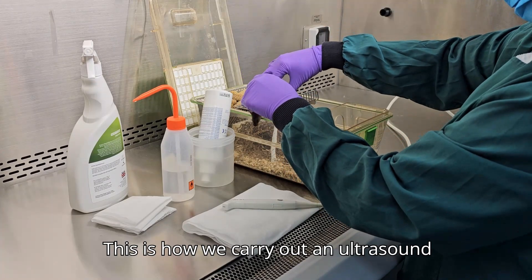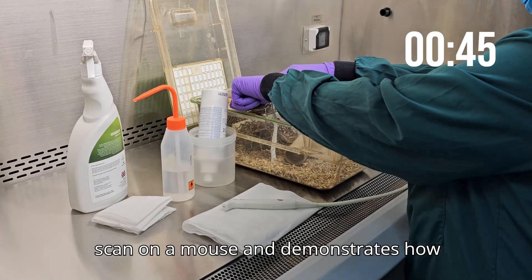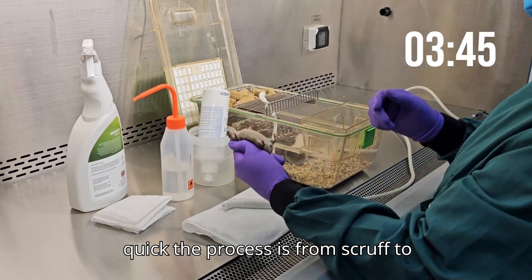This is how we carry out an ultrasound scan on a mouse and demonstrates how quick the process is from scruff to release.